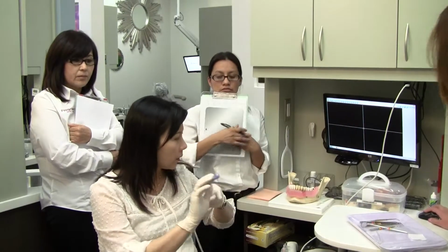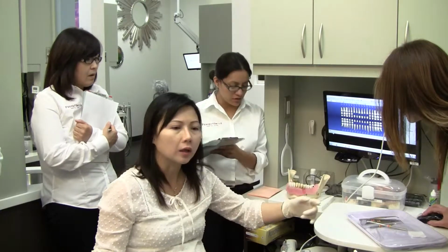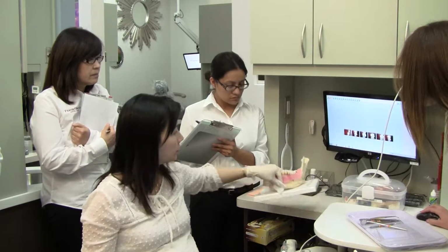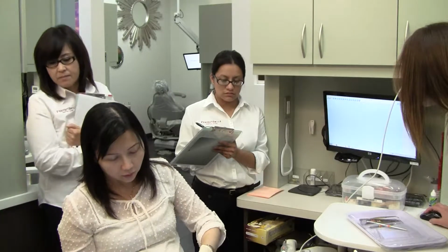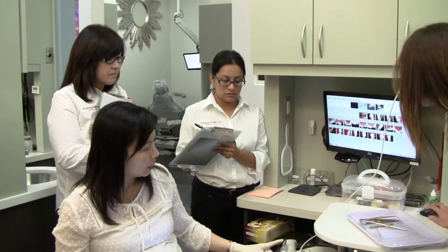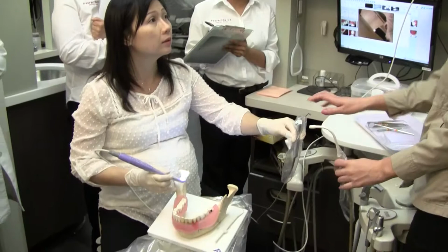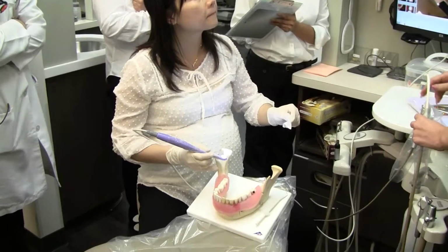And the way I do the photos is, I have a piece of gauze. So I would hold a piece of gauze, dry their teeth, and then also Brittany will come over with the air syringe too. And the same thing when we do the exam, huh, Brittany? Yeah, I think I need to go over how to actually take the photos.